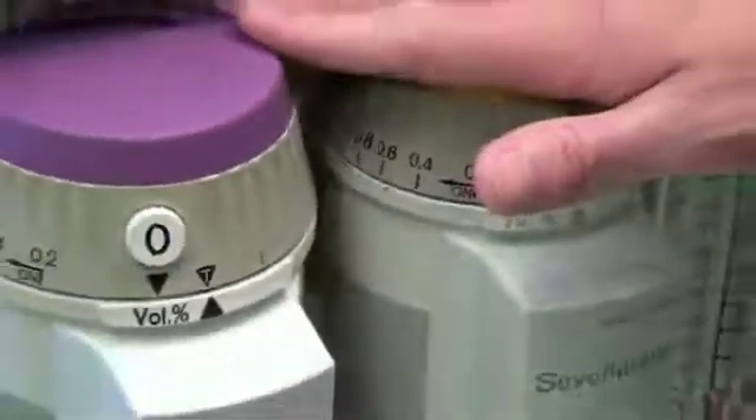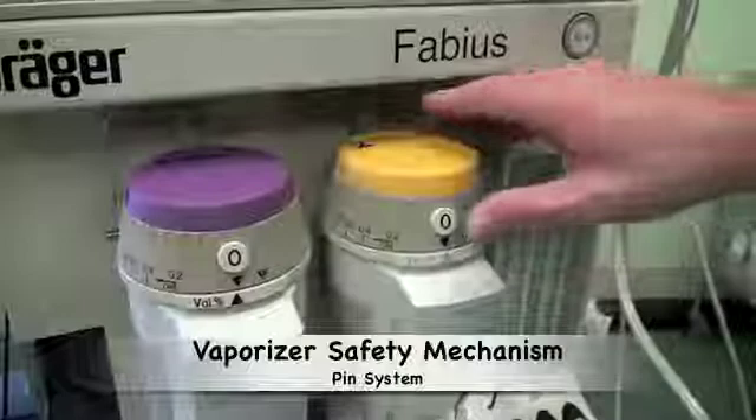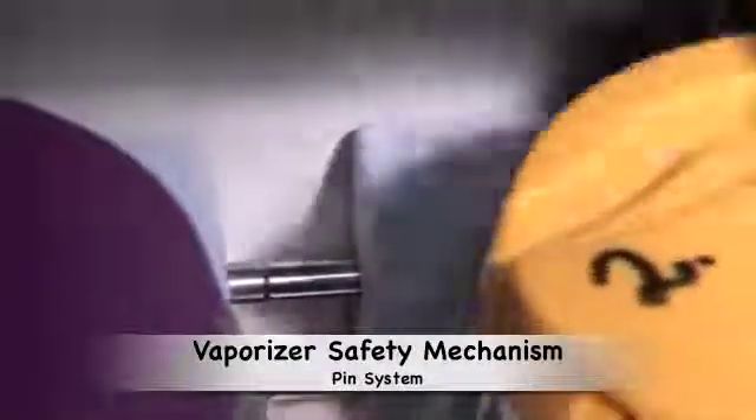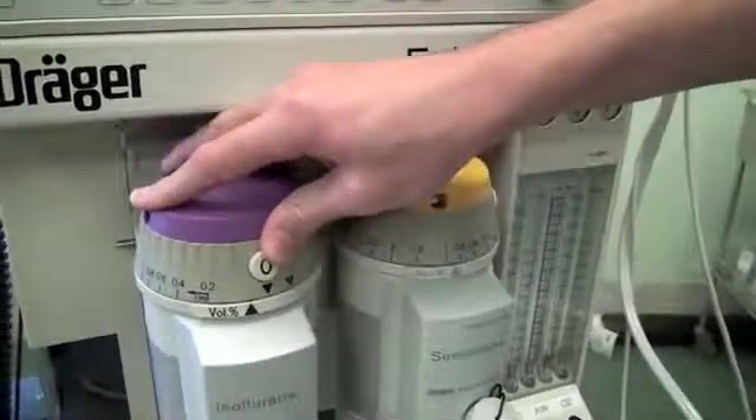When the vaporizer is in place, you can put it into the neutral position. The vaporizers have a built-in safety mechanism that ensures only one vaporizer can be open at a time. When one vaporizer is opened, a pin system moves to prevent the opening of the second vaporizer.